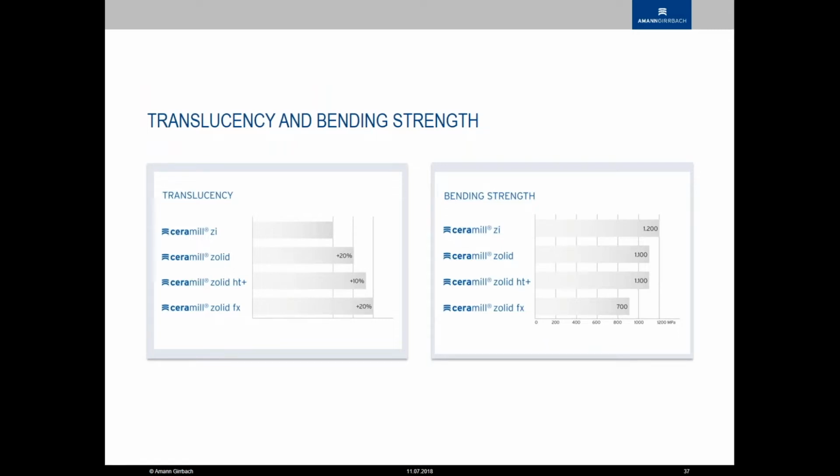Normally the stronger a material is, or at least that's applicable for zirconia, maybe even for all of them, I would have to think about that. For zirconia, for sure, the stronger the flexure strength a material is, the more opaque it normally is, and the more translucent or the more aesthetic a material is, the weaker the flexure strength value will be.